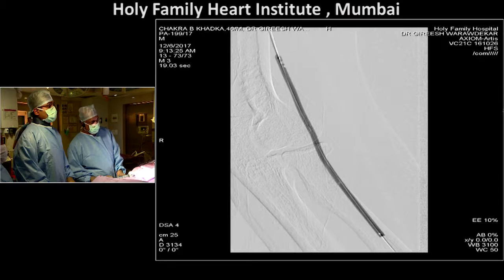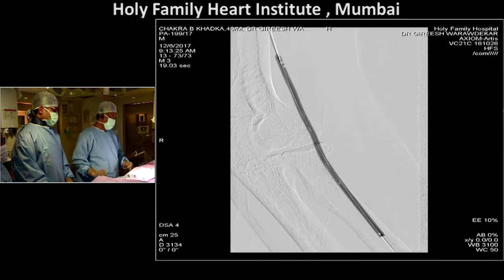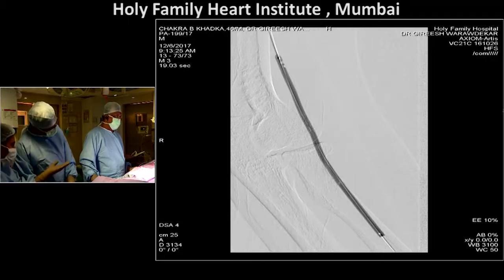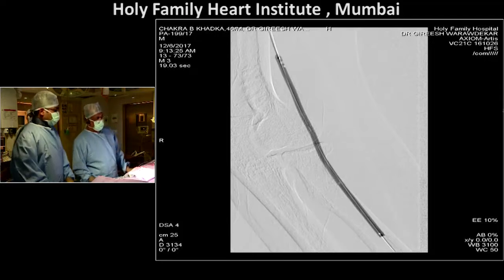I think even aspiration, for the same reason that thrombolysis doesn't work, I also don't pick as a first choice, especially after 4 months. But if it is within a month, even though acute is less than 2 weeks, up to a month I think it is okay. We can try thrombolysis or even aspiration. Correct. Perfect.